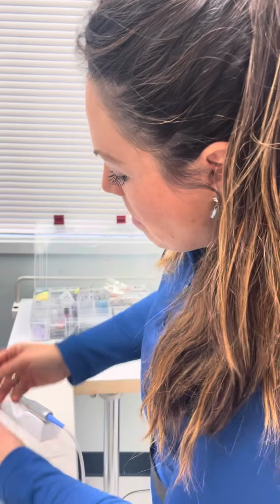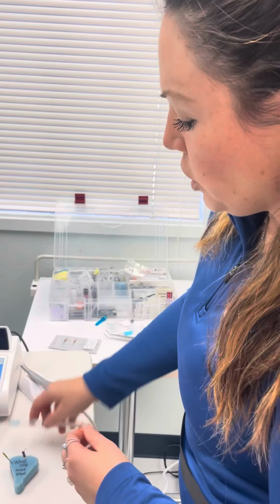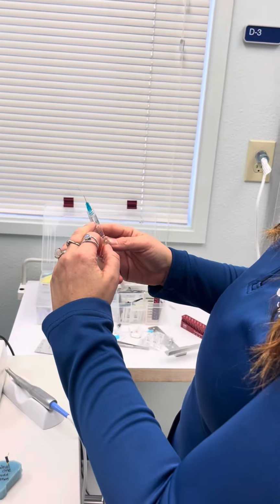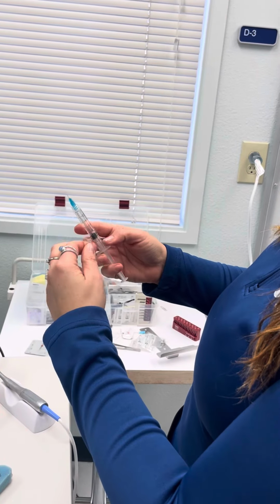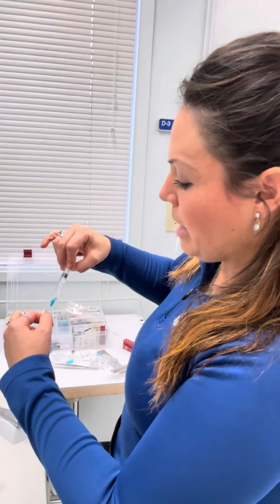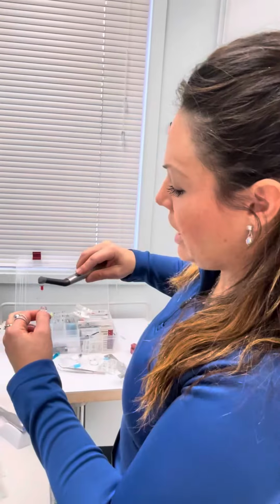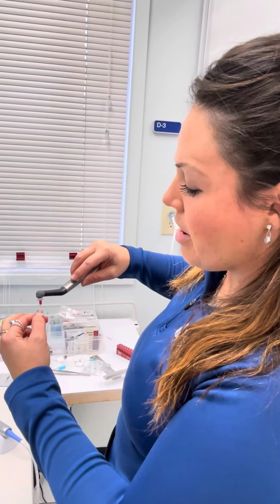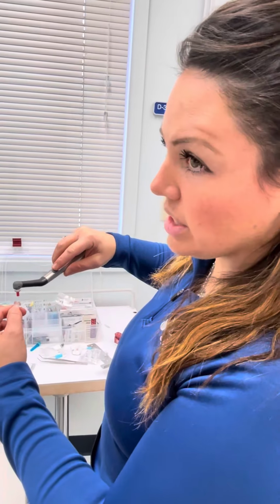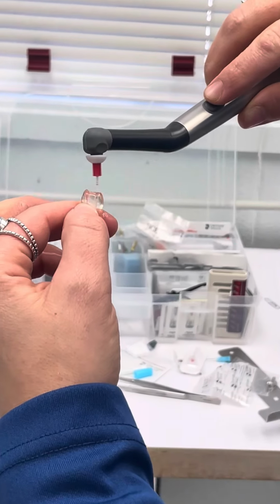So now you have that much more sodium hypochlorite. We're recommending 5 milliliters per canal. You're just going to go ahead and dump all that in there, get it all out of there. Passive irrigation, still recommended. And then here's where you're going to endo activate for 30 seconds at least. Ideally it's 90 seconds, but we all agree that's way too long.